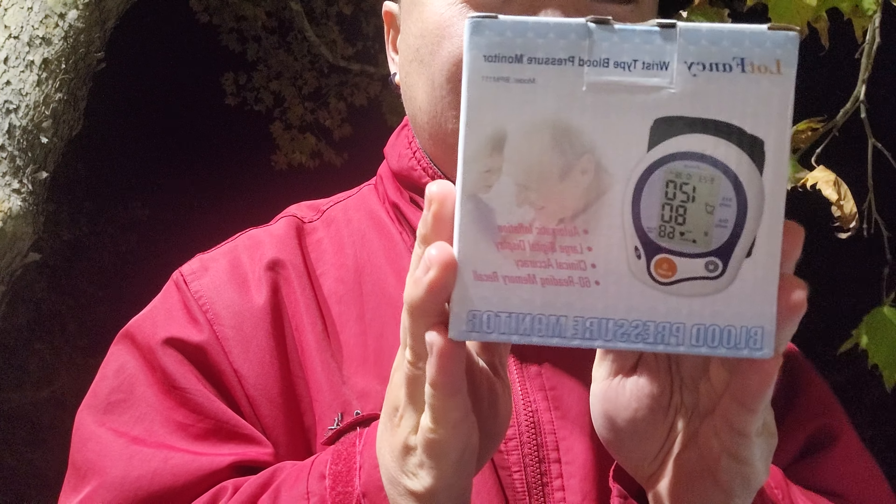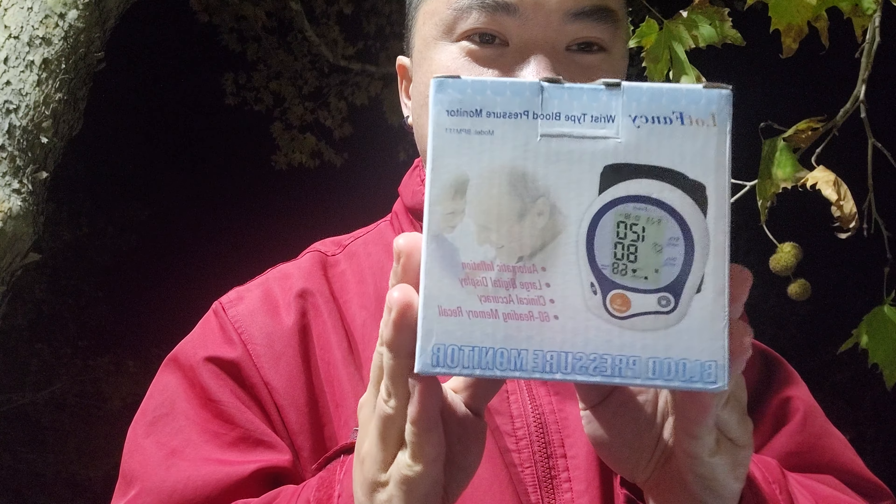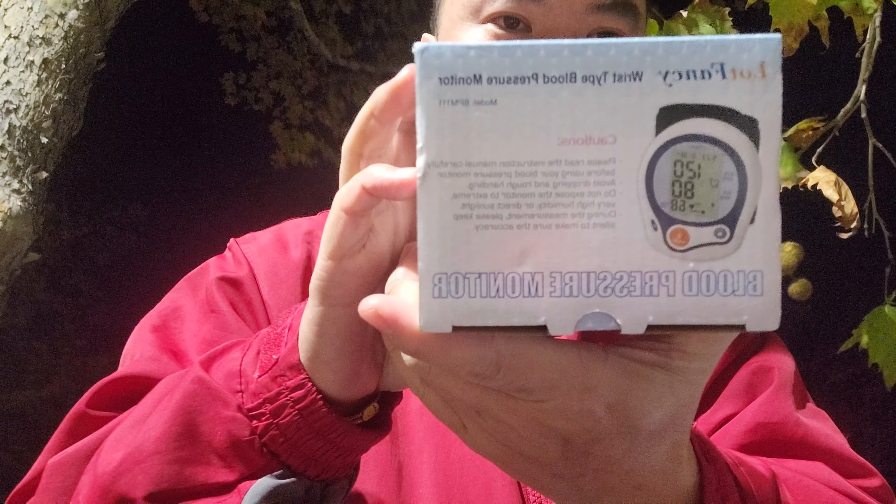For today, the video is mainly going to be about a blood pressure cuff that I recently bought. I guess this is the front right here. You guys probably see these on Google or stuff like that online. It's obviously made in China, that's why it's cheap. I don't remember exactly how much I bought this — probably like 20 bucks, or less than 25 bucks with shipping.